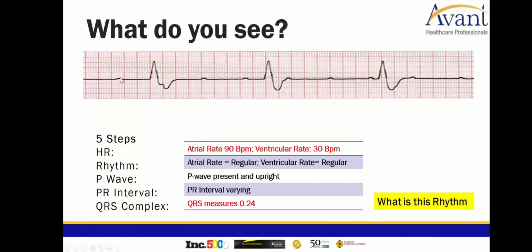So for example, this is a P, and if we march it out, this is a P here. It just landed near the T wave. This is a P, a P, a P. Here we go. Follow the bouncing cursor, and you can see and count your P waves, and you can see that they're regular. In case you missed it, here's a P, there's a P right here. And if you use your calipers, you can see how they easily measure all the way through.